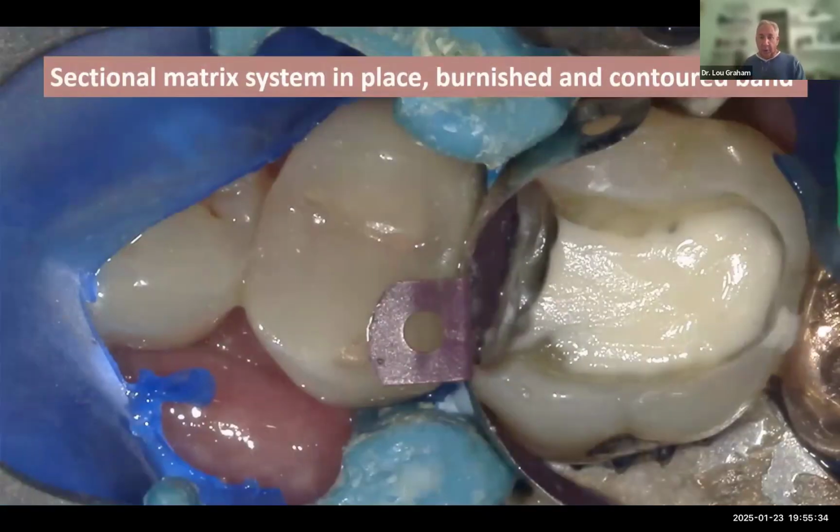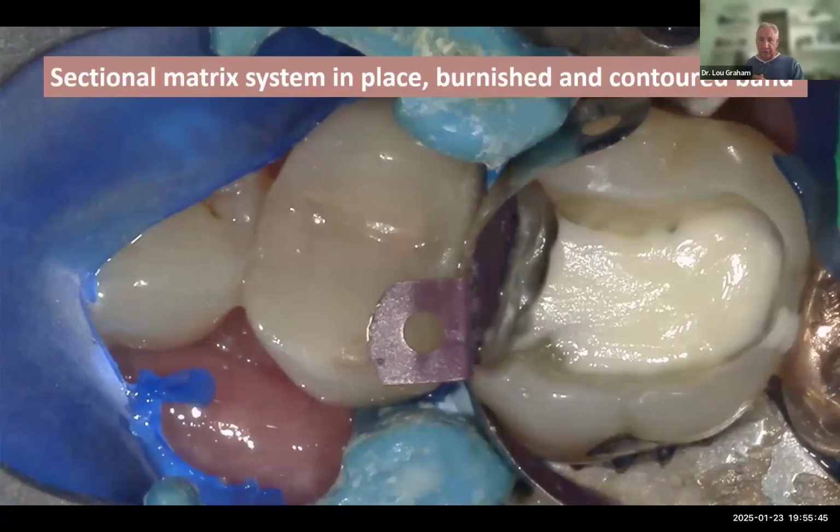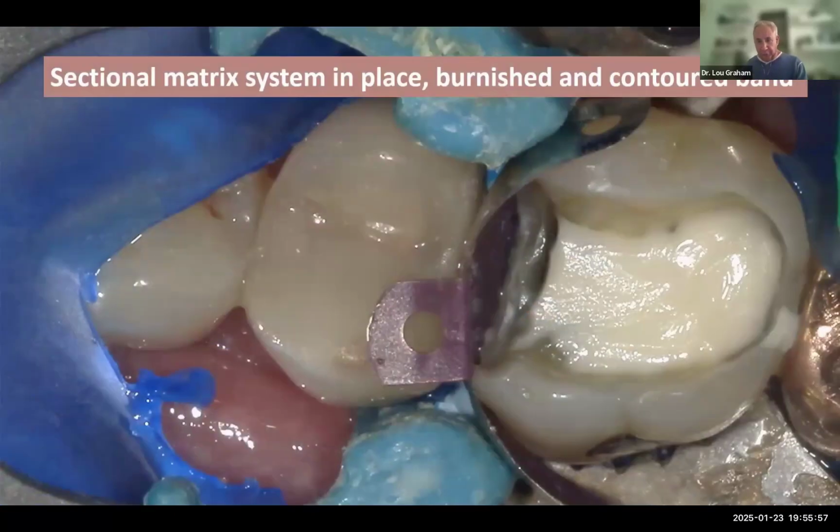And I'm just going to go back one slide. You see that red burr, that red finishing burr, composite finishing burr. I take that on my occlusal line angles just to bevel my occlusal line angles briefly. There's a little extra left on the distal. We'll get rid of that. But you can see I've flattened my floor. Sorry. I want to have at least 2 millimeters of space for my final occlusal composite. This is not in the gingival box at all.